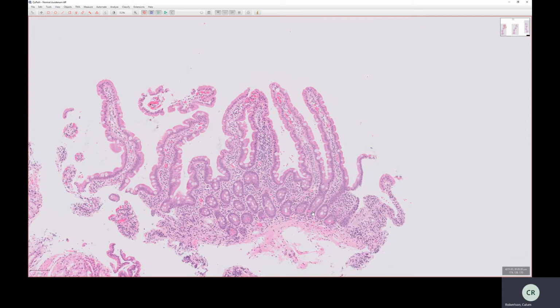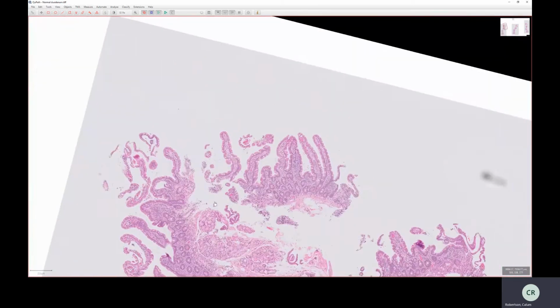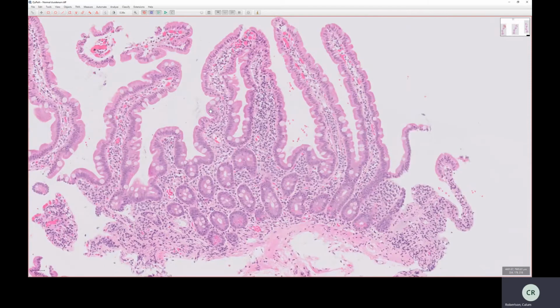Those are the features of celiac disease. But it's beyond the scope of this video to talk more about that. And this is not an example of celiac. This is normal, but that's one of the things you're looking for.